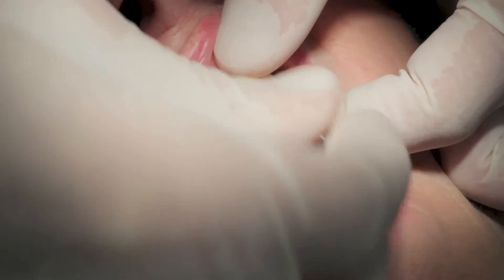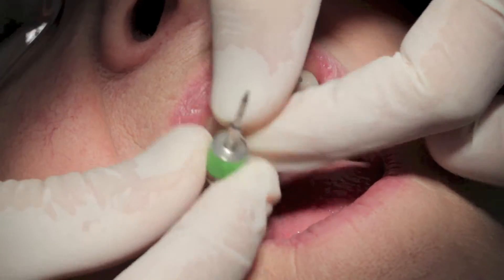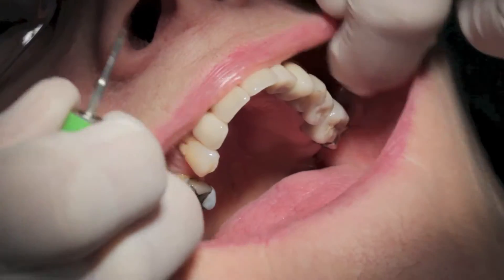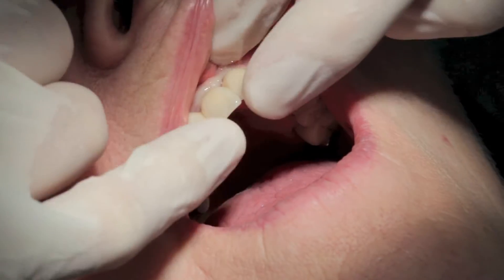So the contact points are fine — certainly not holding the bridge from fully seating. The soft tissues are responding well, so I think we're able to fully tighten the screws. Now this screwdriver has a torque control aspect to it — this is 15 newton centimetres. When tightened to 15 newton centimetres, which is what the screws should be tightened to, you're unable to tighten it further because there is a cutout mechanism within it. That's what that click is. Right, so we're fully seated.